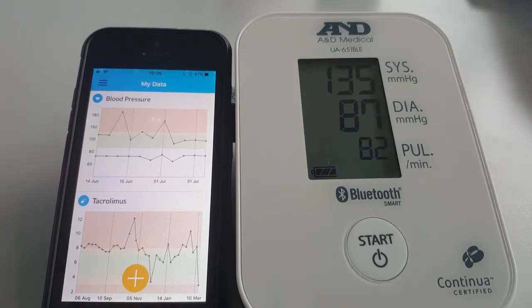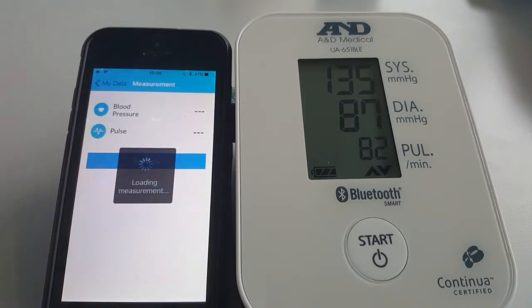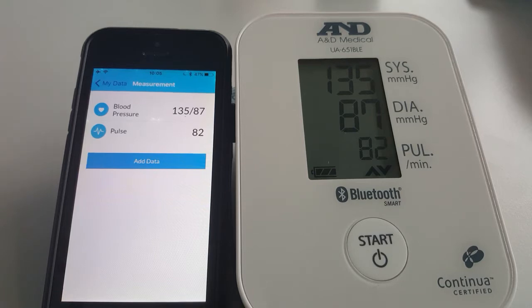When the reading is complete, the data will import automatically. And to confirm the addition of the data to your app, press the add data button.